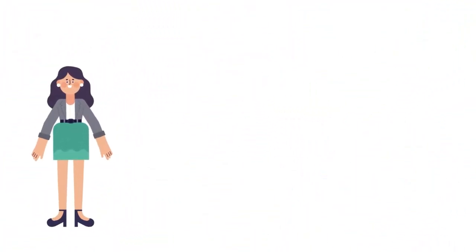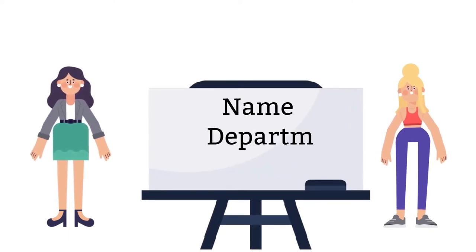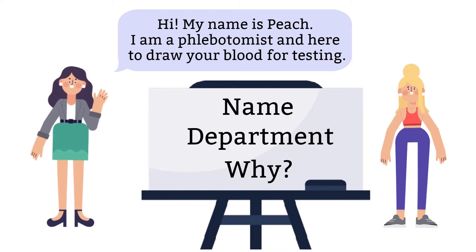The initial process is the same as straight needle collection, because you still have to identify yourself, tell the patient who you are, what department you are from, and the reasons you are there. For instance, my name is Peach. I'm a phlebotomist from laboratory, and I'm here to draw your blood for testing.